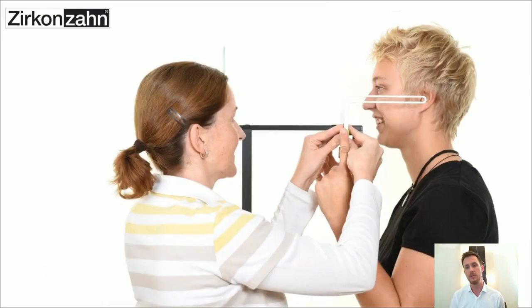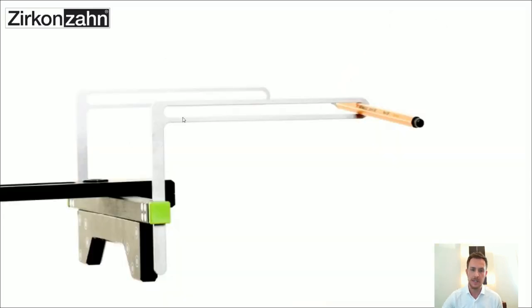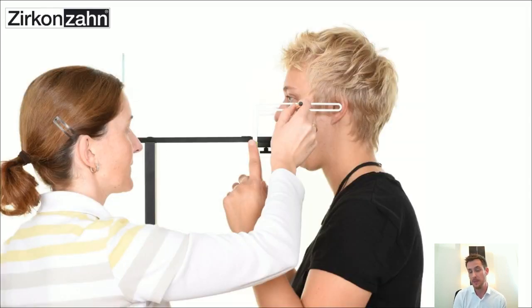First of all, we have to be sure that the patient can take or reproduce their natural head position at any time. To control that, we use a special angle, as you can see in the picture. We put it inside the plane finder, and this angle is an open instrument, so you can put a pin or a pen through it, and with this pen we are able to mark the patient's face with two dots or a straight line regarding this angle.